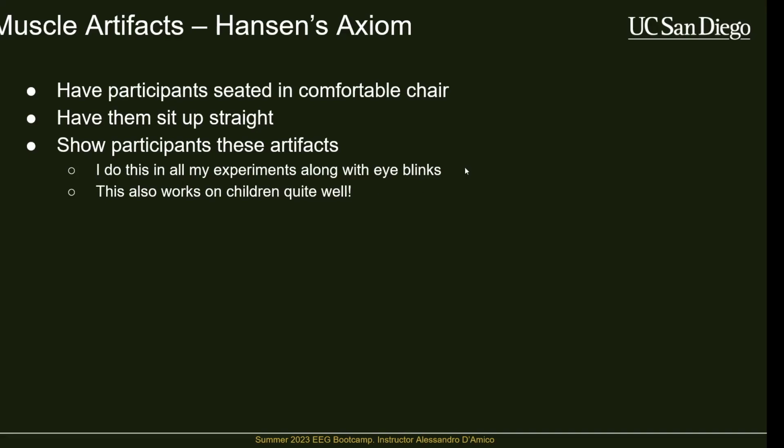And you also want to just show participants these artifacts. This is incredibly useful. I'll have a subject sitting there with their cap, and I'll have them relax, and the traces will get nice and clean, and then I'll have them clench their jaws, and you guys are all going to do this, and it just completely destroys the data. And once you're bridging that connection between what you're recording and what the subject is doing, people tend to piece it together, like, okay, this is very obviously ruined. You don't have to be an expert to see that those signals have distorted everything.